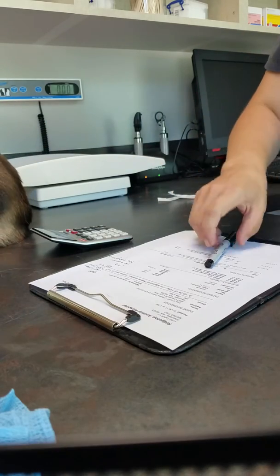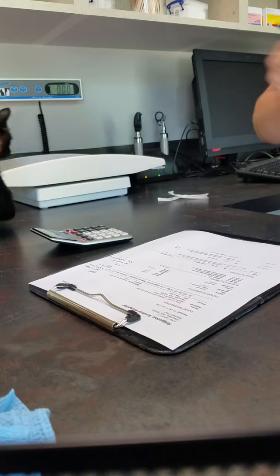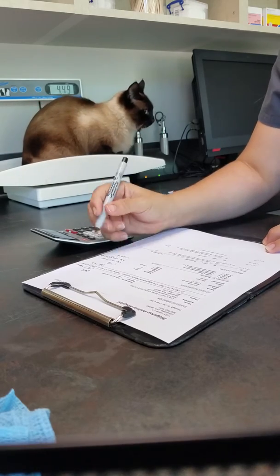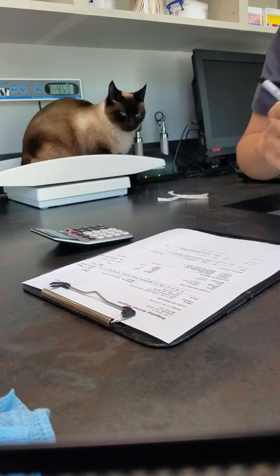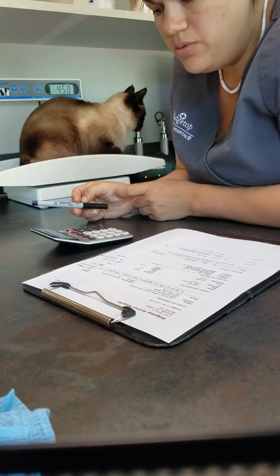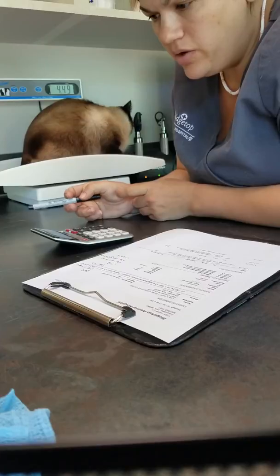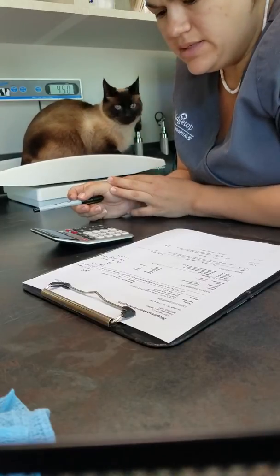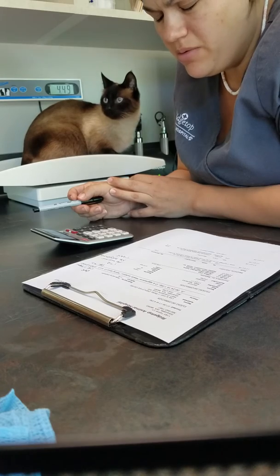Okay, so I got 99.4. So I'll go ahead and chart that down. And the normal temperature is supposed to be 100 degrees to about 102.5. Anything higher or lower can indicate a problem. His is like 0.6 lower, but I don't think it's an issue.